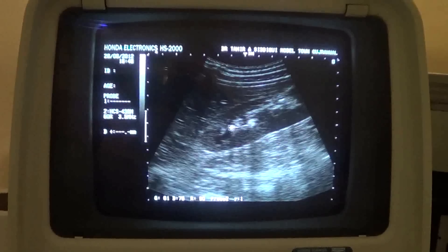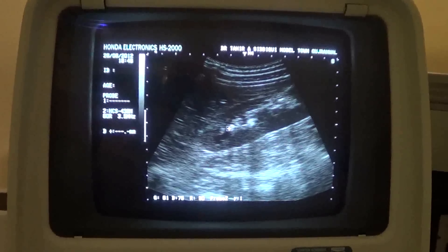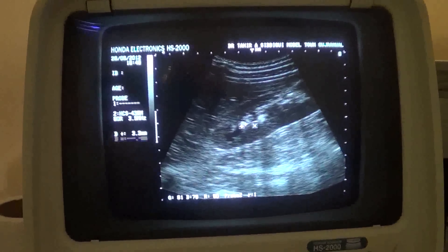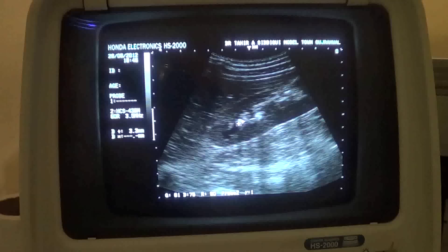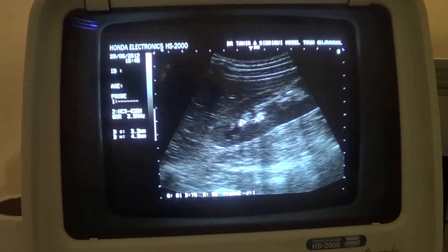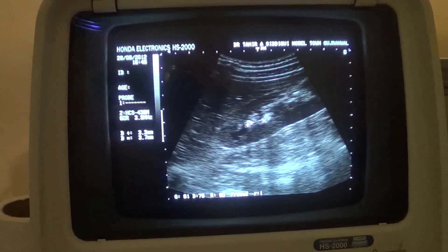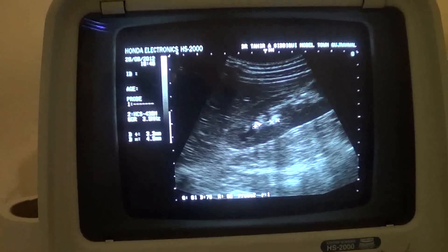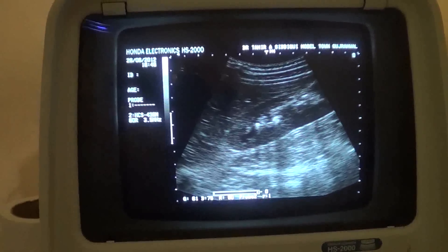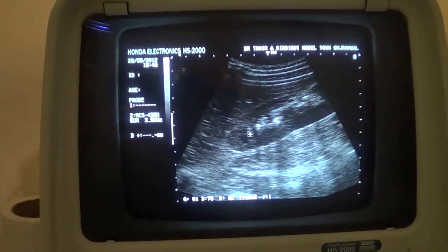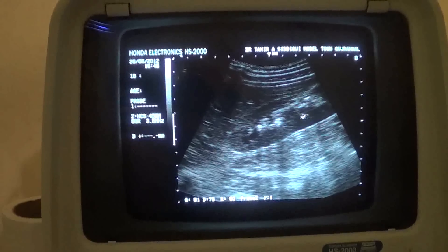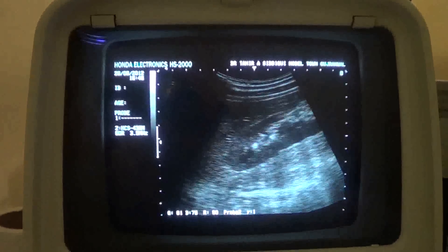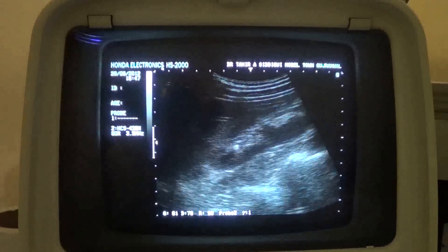One is this, and the second is this one. This one measures 3.3 millimeters, this one measures approximately 4.5 millimeters. And if you see, there is minimal dilation of the central sinus echo complex.